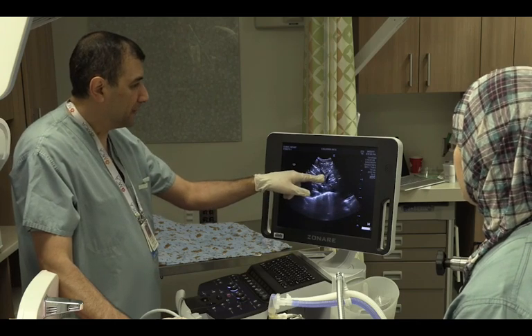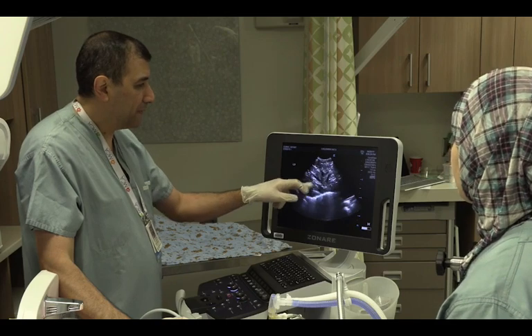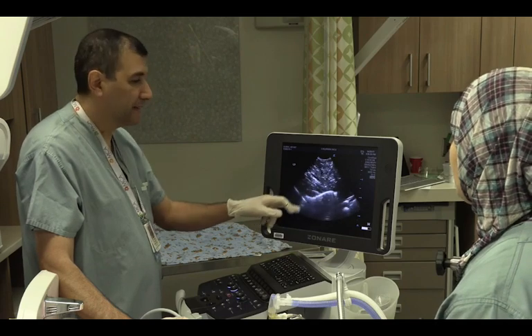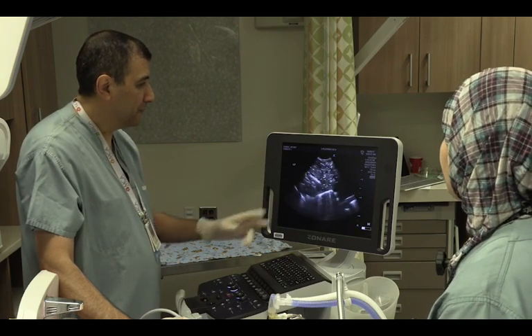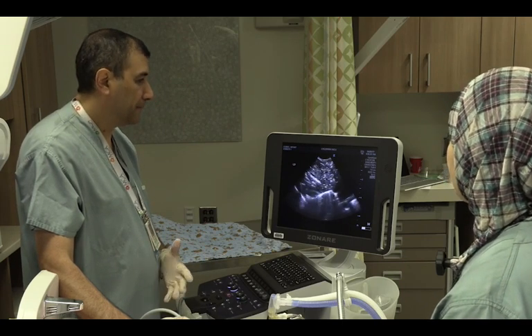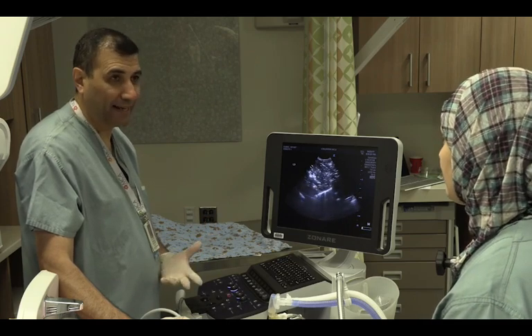There are a lot of moving artifacts, which are actually air bubbles moving inside the portal veins, and I can see the liver is full of bubbles. I can see some bubbles keep moving inside. So there is extensive portal venous gas, and there is no other explanation other than significant NEC in this case.